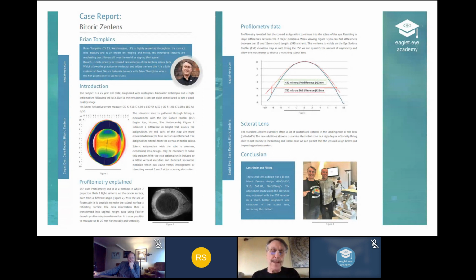When I first saw him, he was about 14, and of course, getting any form of measurement for Sean is really difficult because the nystagmus rocks his eye from side to side. But with patience and Sean's real dedication, we got some really good ESP images on the version of the ESP that we had at that point. And ultimately, that we gave to Reinier and the team.